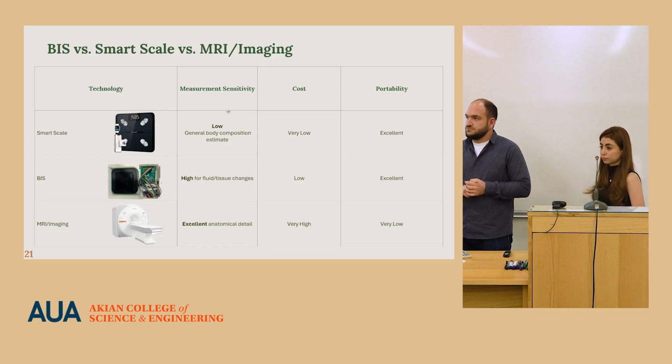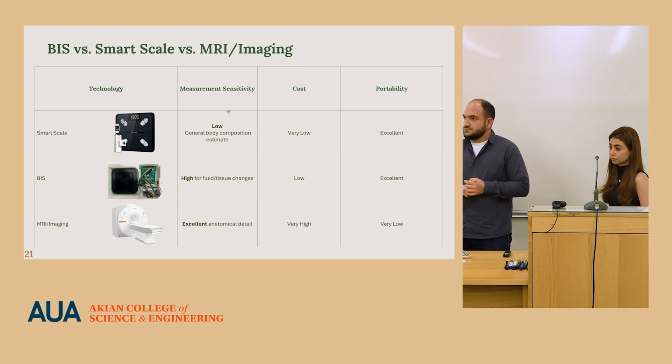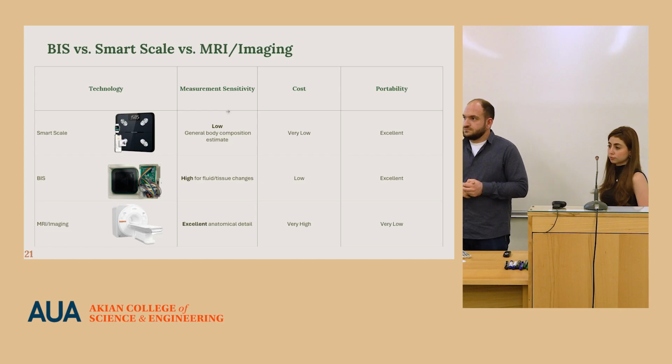but that your device parameter doesn't help. You have mentioned in the paper that it works between 15 and 30 degrees Celsius, whereas the patient can have up to 40 to 41, and we should think about it because if we are looking at the immediate changes in hydration levels, which the patient has to pay immediate attention, then this has to be taken into consideration. Of course. As a development advice. Thank you very much.